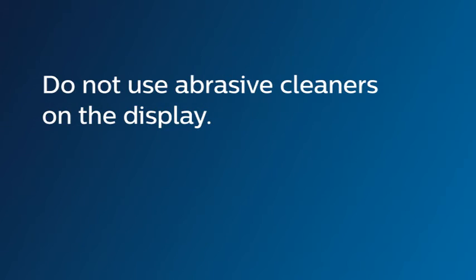Be particularly cautious when cleaning the display, as it can be scratched by abrasive cleaners. After washing, use a soft, dry cloth to remove any residual cleaner. Allow the device to dry completely before plugging in the power cord.